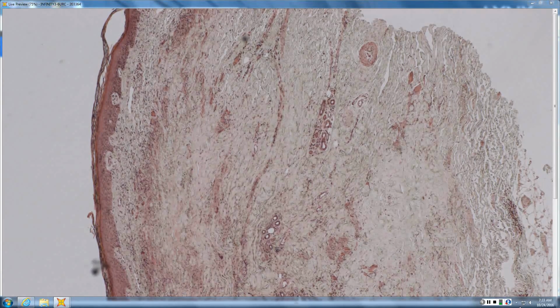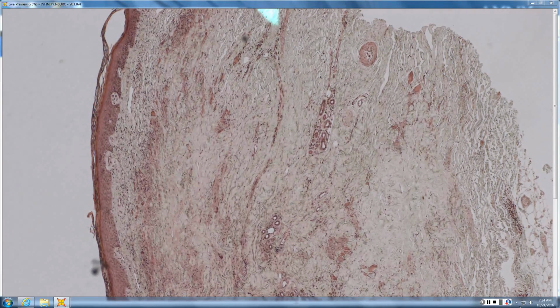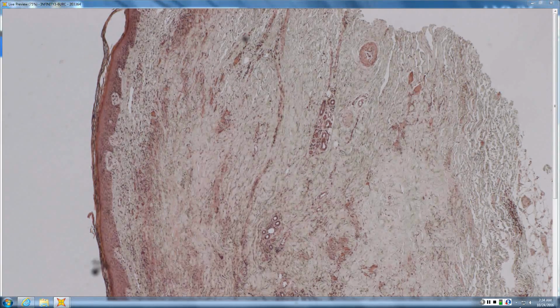So go ahead and tell me about the pattern of your granuloma. So it's palisading, I guess, since we are talking about washed out. And the palisading granuloma, is it making circles, is it interstitial, or is it just one solid line? That arrow looks interstitial, but maybe I was imagining more under the arrow there. It kind of goes in a circle. Okay, so if you did that, you're leading yourself towards what diagnosis? GA.